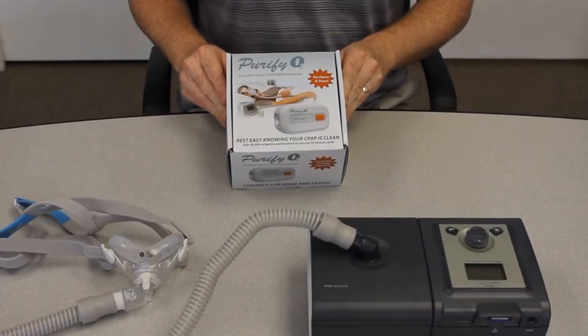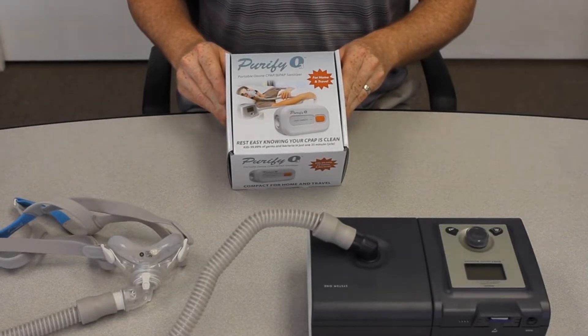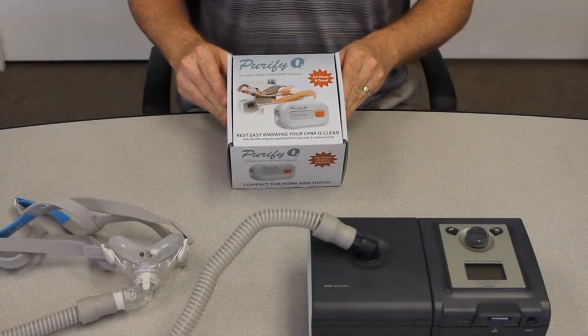Today we're going to go over the Purify O3 Portable CPAP/BiPAP Equipment Sanitizer from Responsive Respiratory.